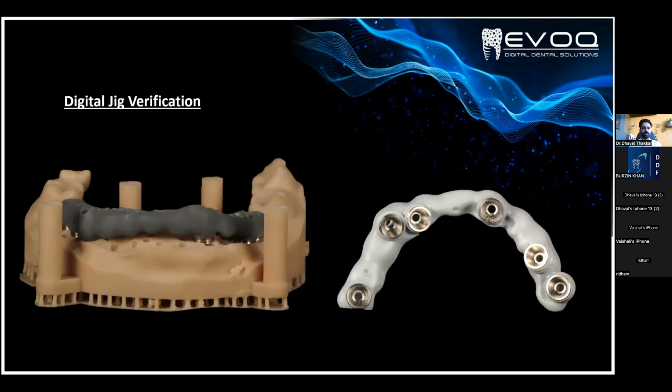So rather than making a pattern resin jig, it is better to go with the 3D printed jig with the titanium base, which is company provided. So we are not incorporating any manual steps over here. We are just taking the 3D printed jig, which is fabricated directly from the patient scan data, which is fitted into the 3D model. So it is directly fitting in the patient's mouth completely passively, and we can do the single screw test also. So this is a completely digital jig verification.